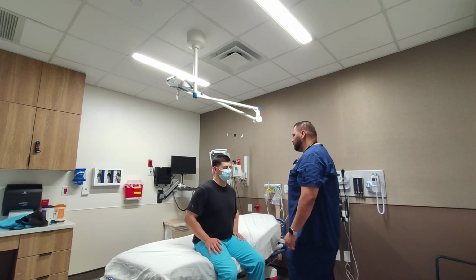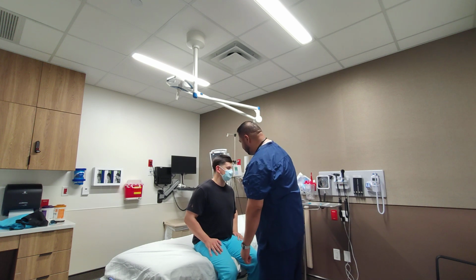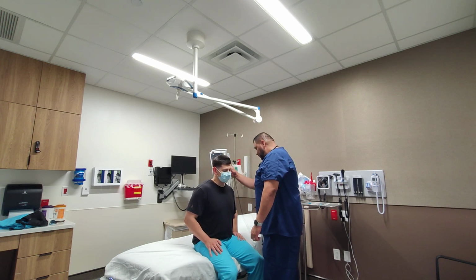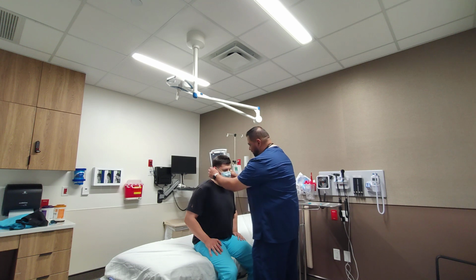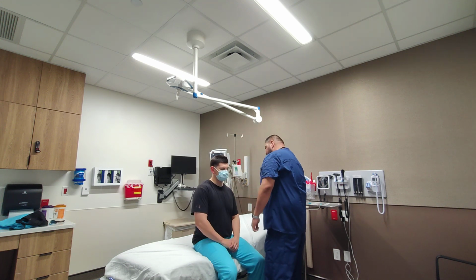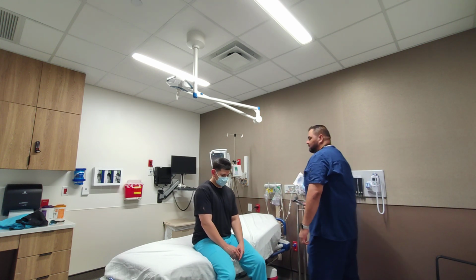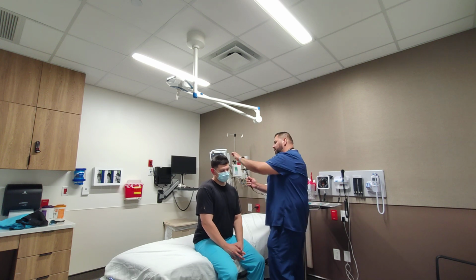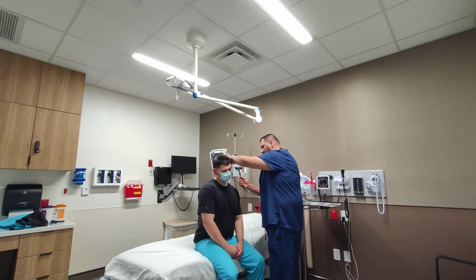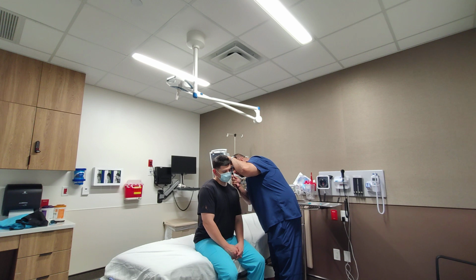Also, we're going to move back up and look at his ears. What I want to do is just inspect his ears at first, making sure they are evenly placed on his head. Okay, I'm going to palpate, noting any tenderness on his auricle or on his tragus. Then I'm going to look inside of his ear and look at his tympanic membrane. I'm going to pull his ear, the pinna, up and back, and look inside of his ear. Going to describe his tympanic membrane, which is pearly gray, no bulging.